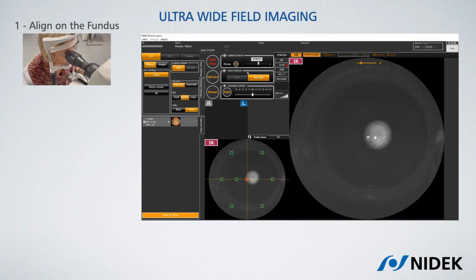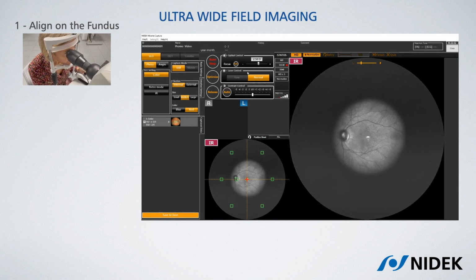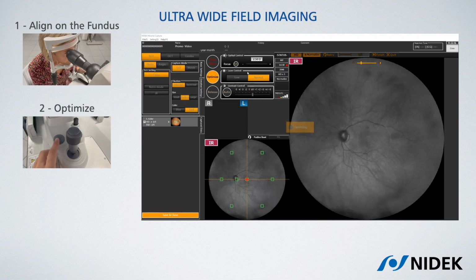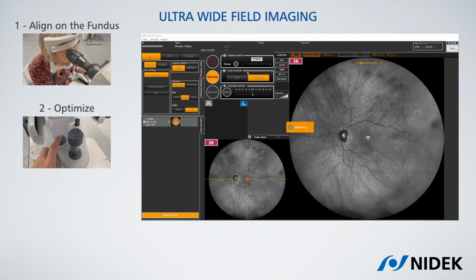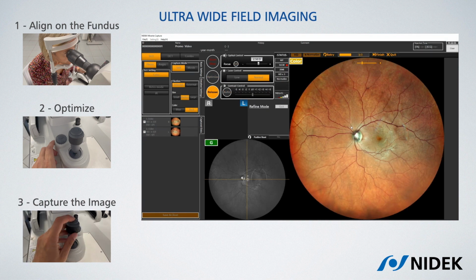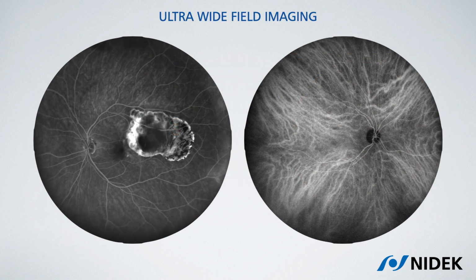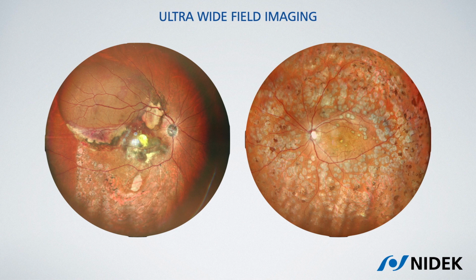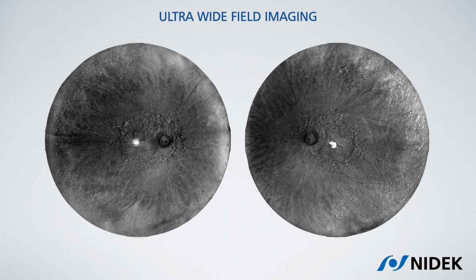As the attachable ultra-wide field lens is more protruding, one trick to try avoiding touching the patient is to swing temporarily and tilt inferiorly the optical head. We can then proceed with the optimization of the fundus pictures and the capture of it. And in this very same way, we can also take ultra-wide field fluorescein and indocyanine angiographies, ultra-wide field color images, and ultra-wide field retromode images.